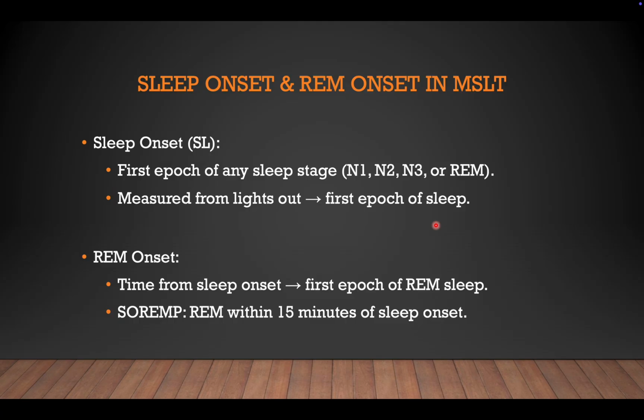The REM onset, similar to the nocturnal PSG, is the time from the sleep onset to the first epoch of REM sleep. And as I discussed earlier, SOREM means REM within 15 minutes of the sleep onset. So this is how the stages of the MSLT naps are scored. The scoring is more or less the same as the nocturnal PSG.